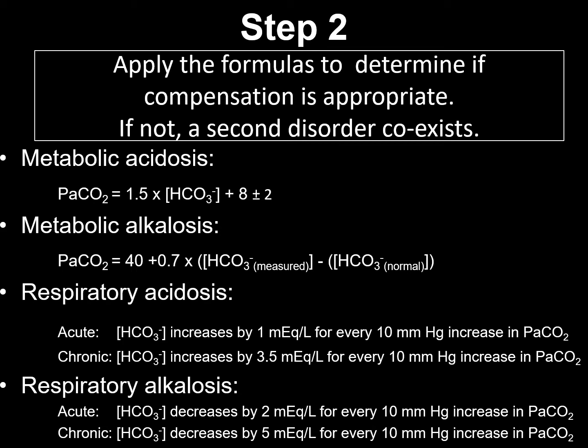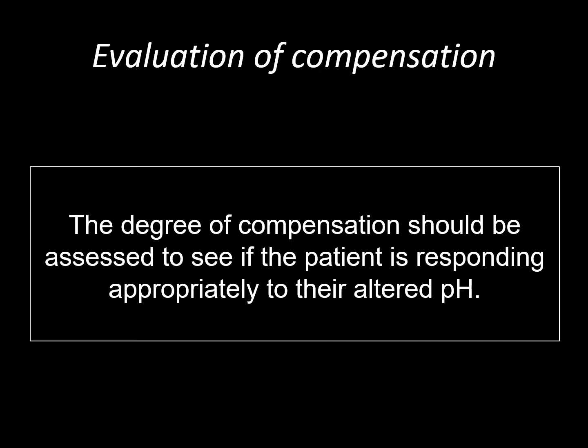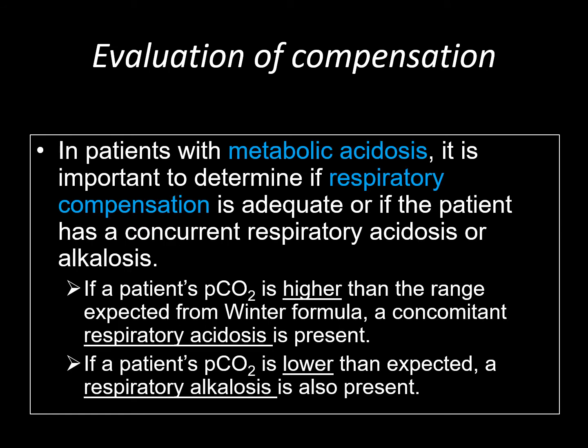The degree of compensation should be assessed to see if the patient is responding appropriately to their altered pH. In patients with metabolic acidosis, it is important to determine if respiratory compensation is adequate or if the patient has a concurrent respiratory acidosis or alkalosis.